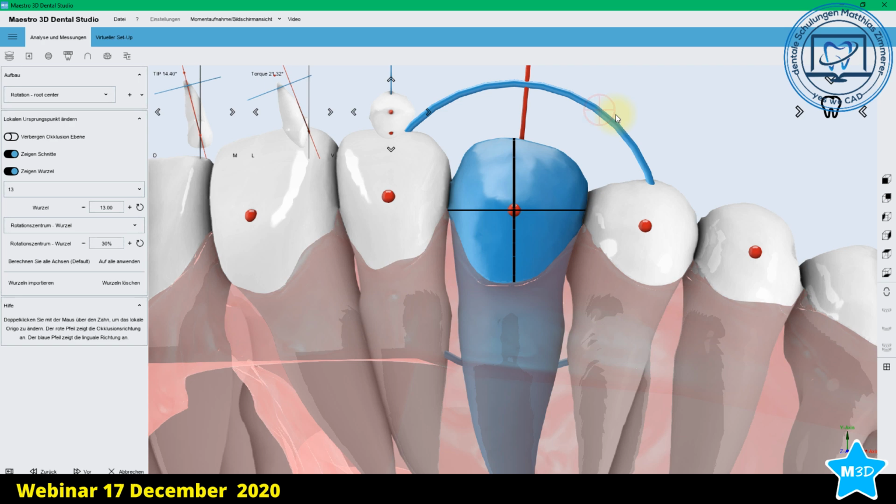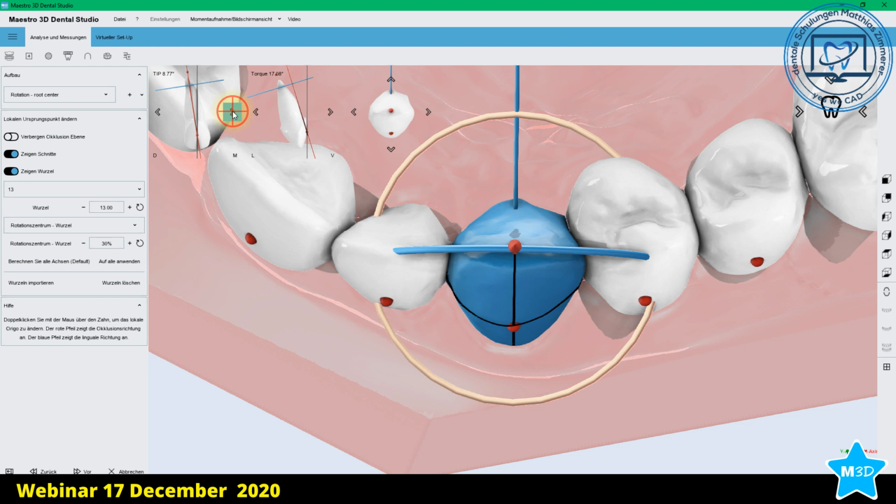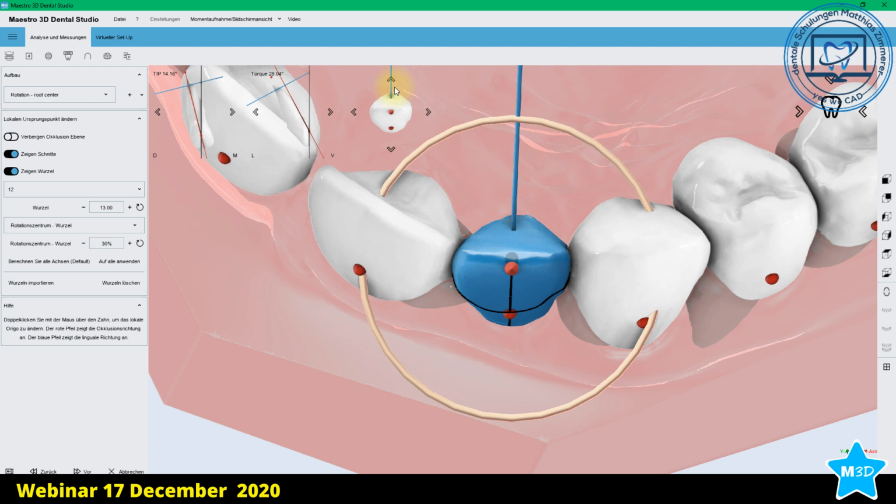Various options. Normally it's not the best to rotate the model all the time. I think it's better to make this from these buttons just the next, and don't move the model the most of the time. Just click on the symbols, very comfortable and fast.